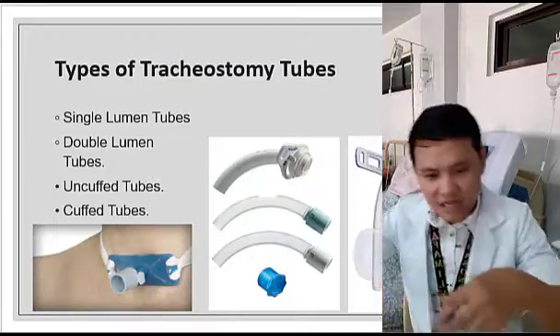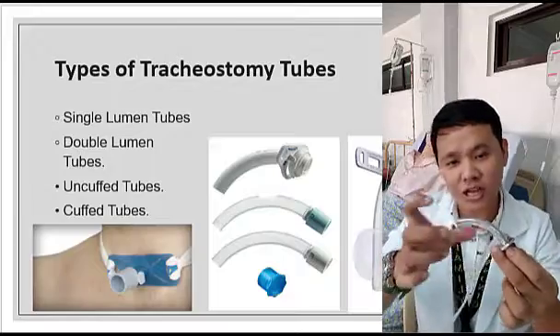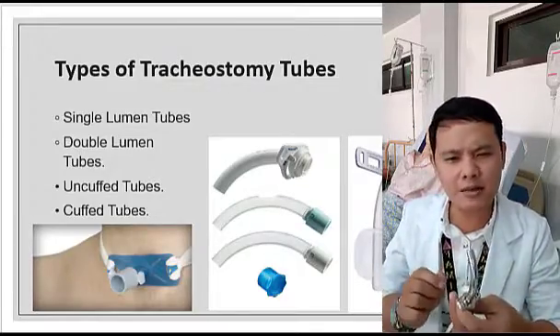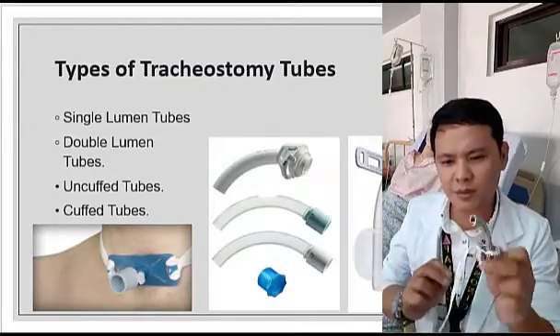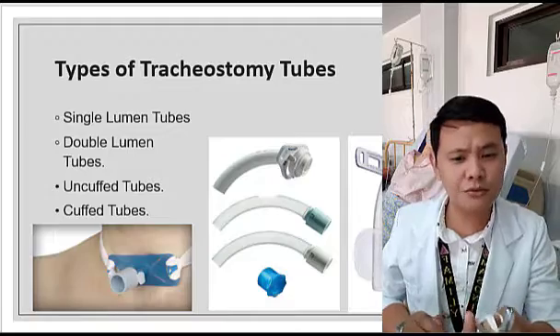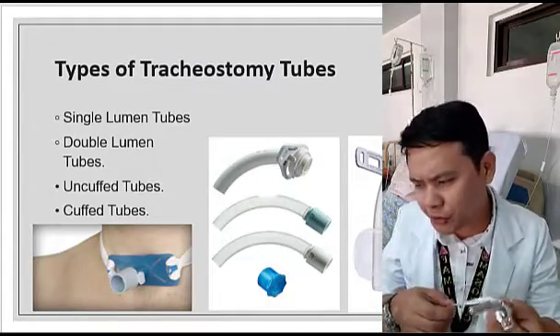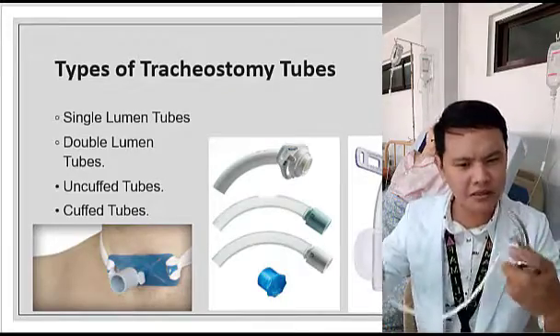Okay, pag sinabi natin uncuff, okay, katulad na to. Okay, this one is uncuff, wala po siyang cuff. So nilalagay lang siya ron, and then there's a tendency na magkaroon ng trauma. So rarely na po na ginagamit ito. Okay, yung mga uncuff tubes. Pero for some emergency cases, tsaka for a short period of time, if you're going to use the tracheostomy for a short period of time, you can consider that one, okay, the uncuff.